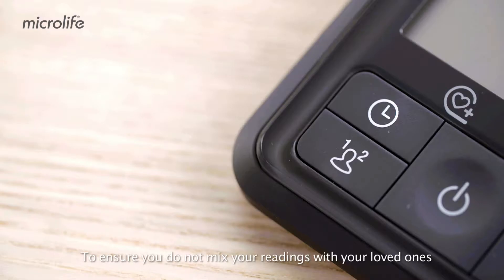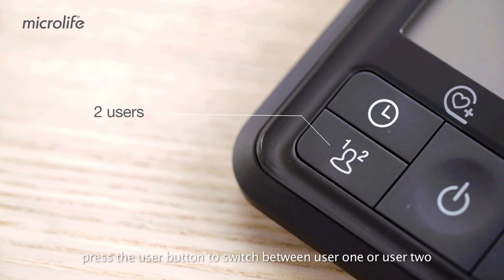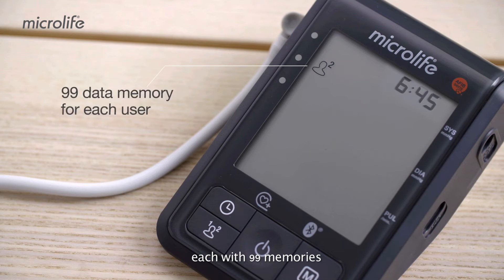To ensure you do not mix your readings with your loved ones, press the User button to switch between User 1 or User 2, each with 99 memories.